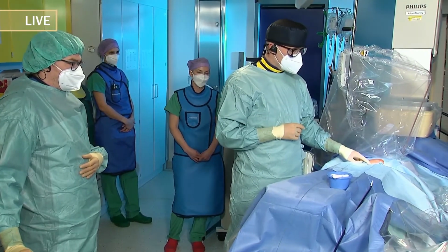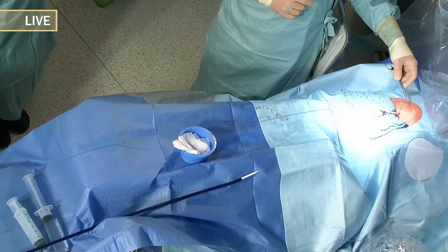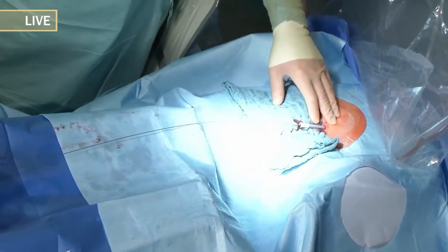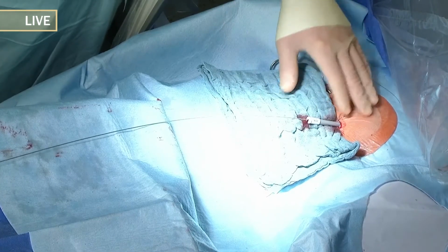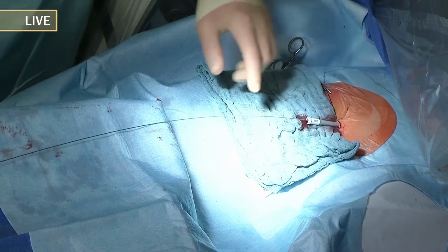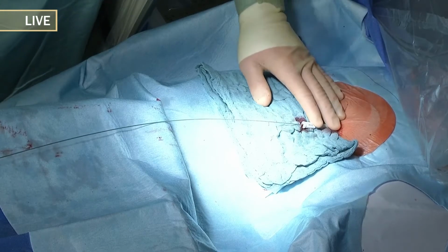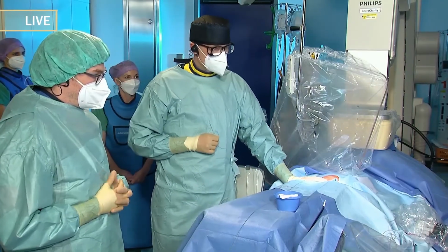So we started with a puncture in the femoral vein. We placed a ProGlide suture before to close the femoral vein at the end of the procedure. The guide for the PASCAL system has a 20 French outer diameter, so we have good experience with closing the groin with the ProGlide system. Now we have placed a super stiff wire in the superior cava vein, and we have placed a dilator so far. So first we would like to introduce the case.